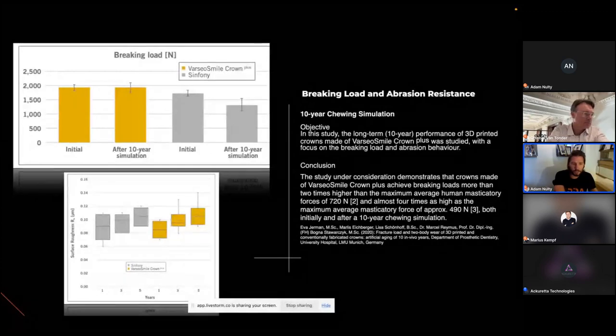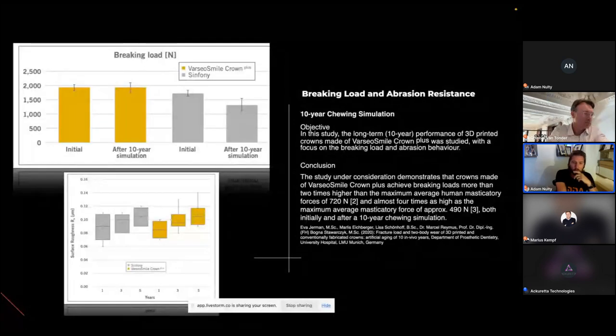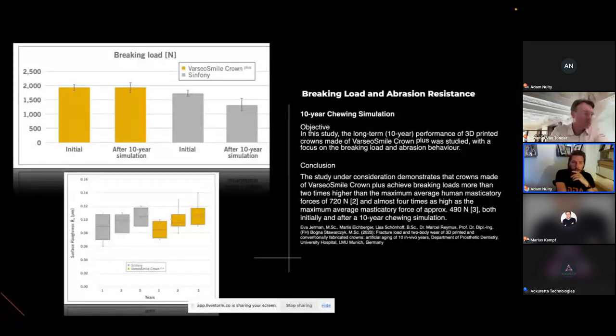So the reality of this is, if we look at it versus normal composites and composites that we would use in a similar smile design situation, the chewing break load and abrasion resistance is similar. Why? Because it is composite. It's highly filled composite resin, effectively. Think about it in a way like flowable composite, but more highly filled. It has its own benefits as well that we can talk about in terms of the layers, which at first we thought of as a negative, but actually, as it turns out, can be a positive.